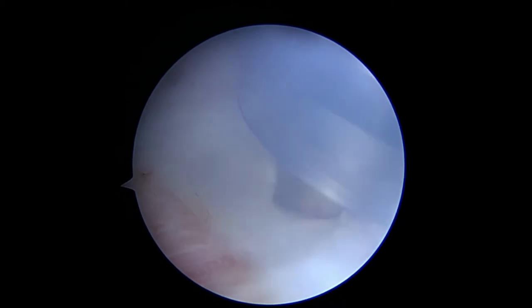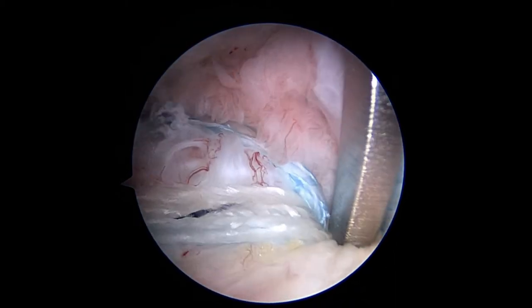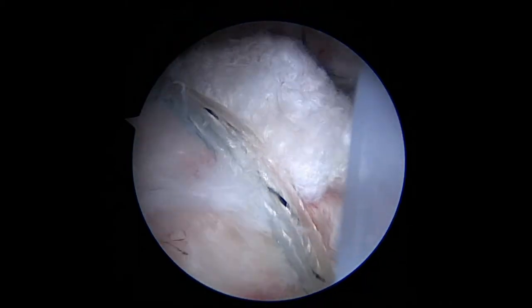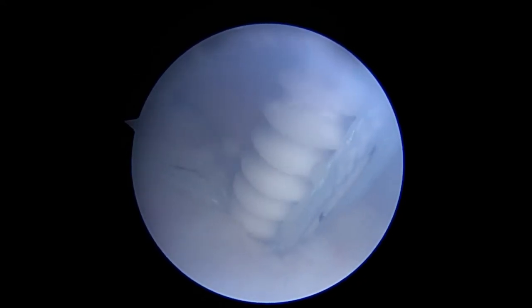A socket is punched into the anterolateral aspect of the greater tuberosity. The swedged fiber tapes from the tuberosity anchors are cut and separated. One fiber tape limb from each medial row tuberosity anchor and the sutures from the lateral double pulley are attached to a 4.75 mm vented swivel lock anchor and fixed into the socket.